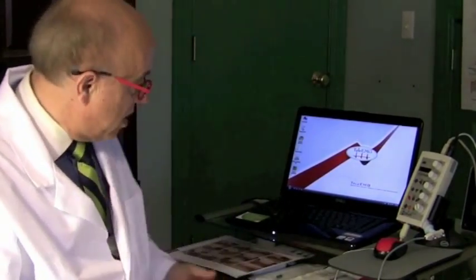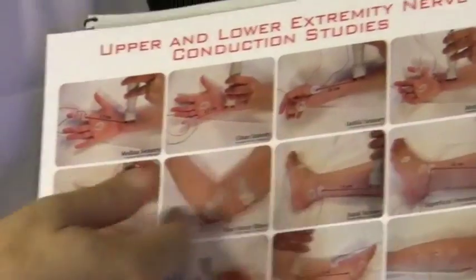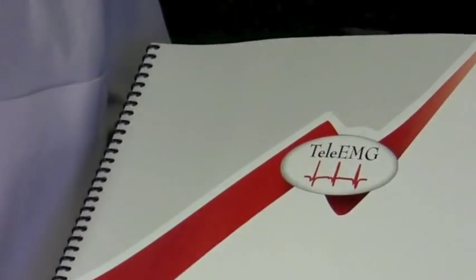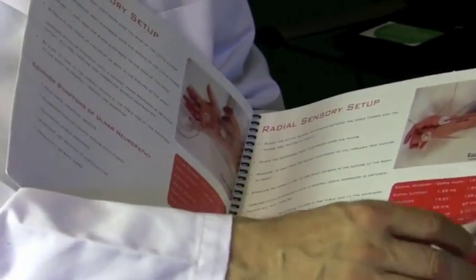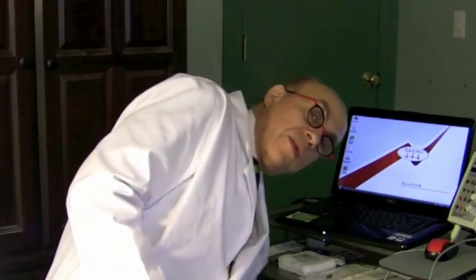But before I do that, I want to show you what I keep with me all the time by my side. I have this laminated sheet that shows you all the nerves that we study in the arm and the leg, and the distances that we use and the positions of the electrodes. And this book, which goes over the anatomy, explains how we explain the test to the patient, shows you the setup for the median sensory, for the ulnar, for the radial, gives you normal values, and shows you the position of the stimulating electrodes. So basically what I want to impress upon you is always have these resources nearby, so that if you forget something, or if you want to try something different, you can always refer to it and see if it's working well or not.